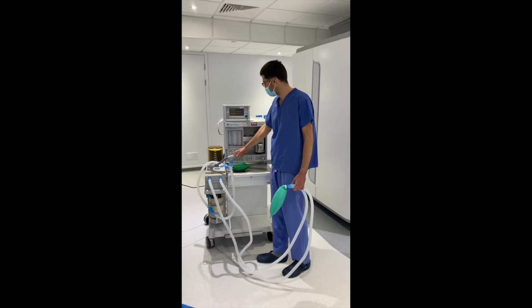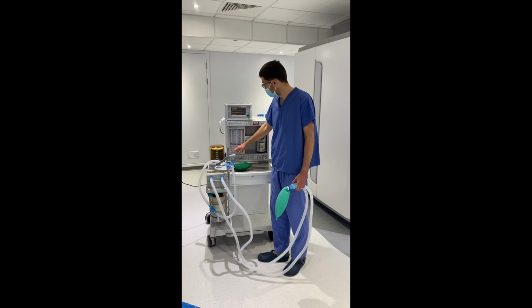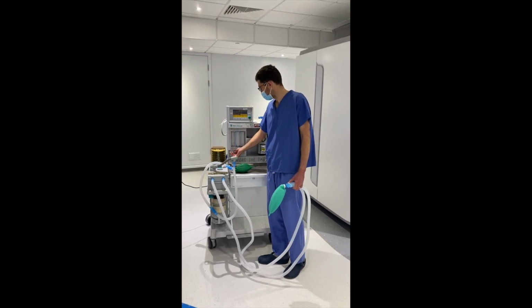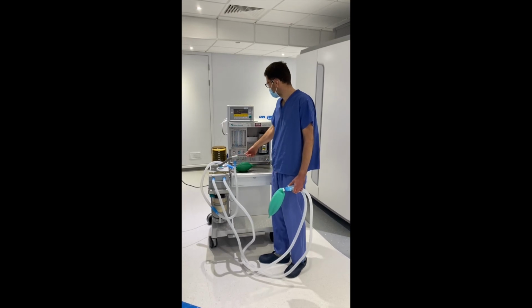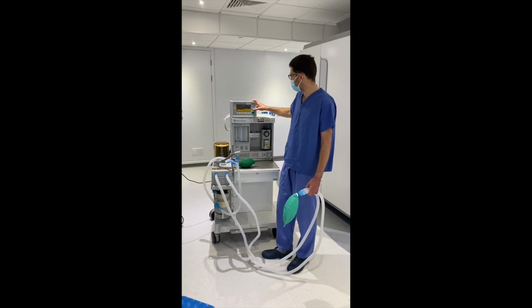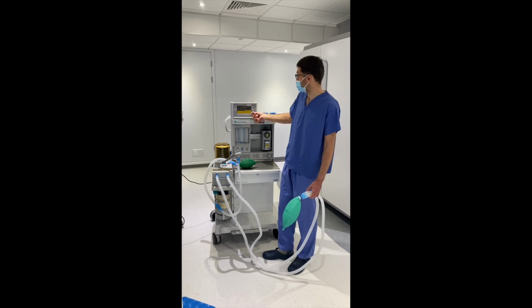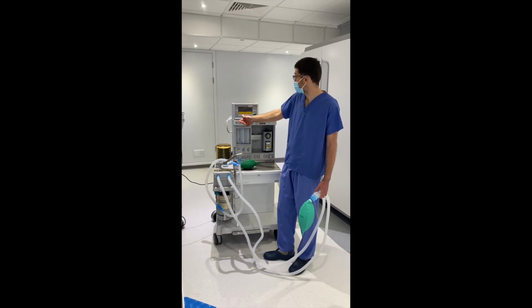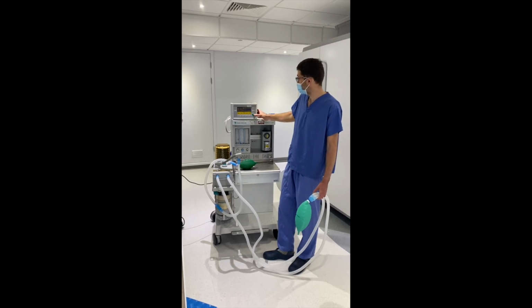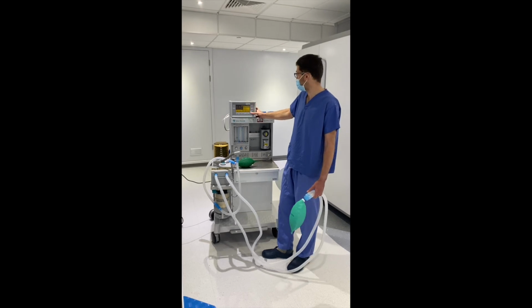And as it's quite an old style machine, you've got traditional flow meters to control your gases for air, oxygen and nitrous oxide. So if I turn some gas flow on, it's defaulted to a volume control mode, because that's the last mode that it was in. To change the settings, you just press these buttons to select. So change the volume, change the rate, change the peak if you want to.